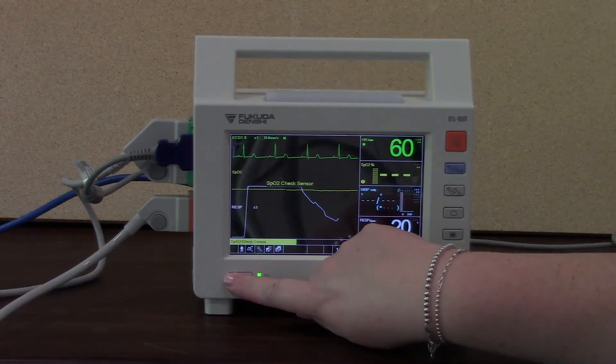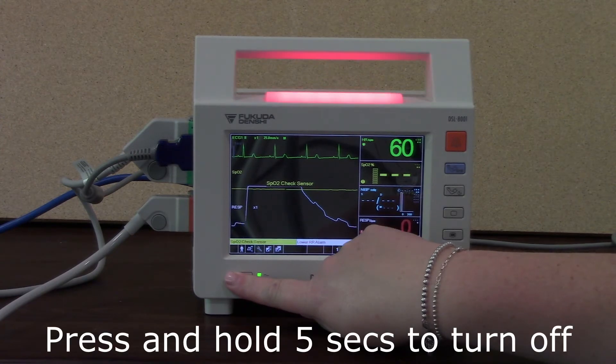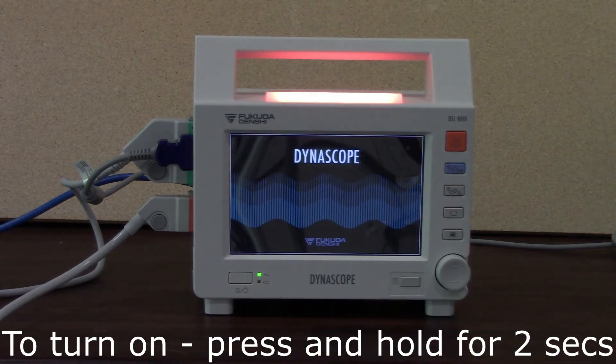To turn off, press and hold. To turn on, press for two seconds and you'll see it will turn on.